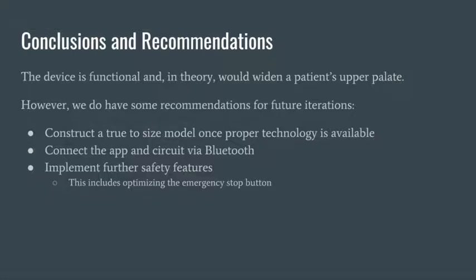One thing that we had wanted to do but didn't quite get around to was to connect the app and the circuit via Bluetooth so that there is no physical connection between anything. The orthodontist would have just used the app and then the device would have responded. But just due to time and the circumstances of this quarter, we did not get to do that.